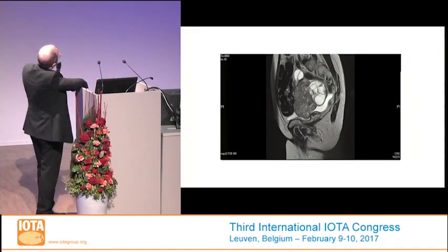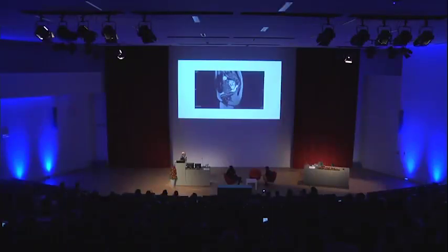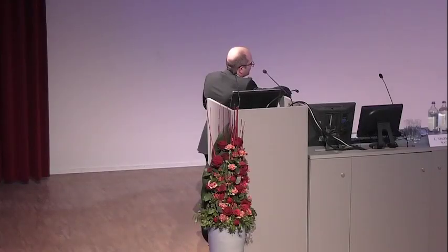Yeah, T2. But finally, if you have an involvement of the sigmoid, you don't need MRI, you need staging. So yes, we can see that, yes, probably, but we don't have injection. There is a mixed mass with a possibly solid tissue at the anterior part and multilocular cyst at the posterior part. So it's a complex lesion, but without any other sequence, I can't go further than ultrasonography, and that's why probably when we do an MRI, it's useful to have a full MRI. And we don't do better than ultrasonography with only this sequence, I think.